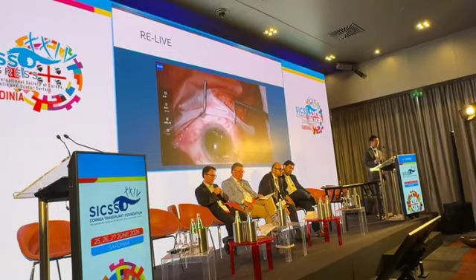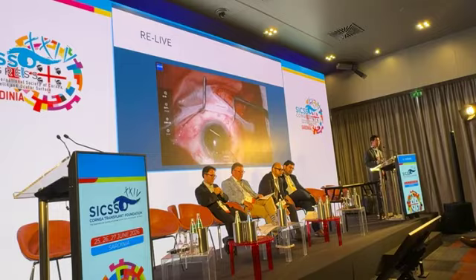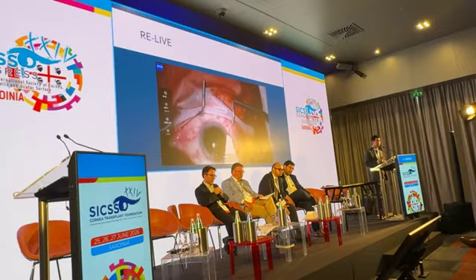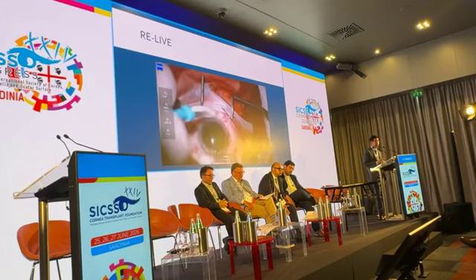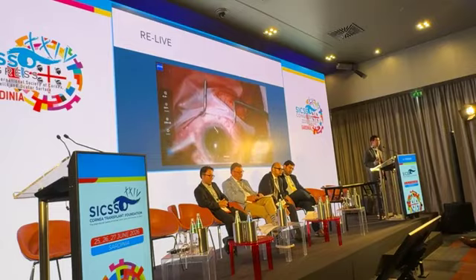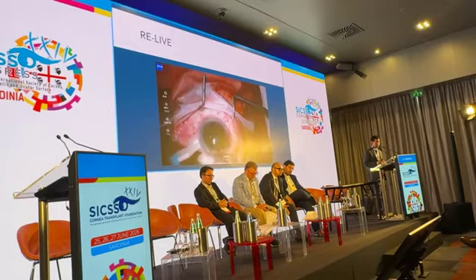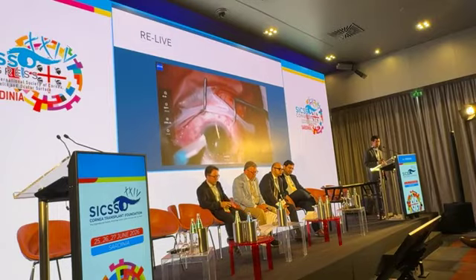The reason why I spend so much time doing this is because you want to minimize any of these wrinkles. That way, there's less chance of it sloughing off in terms of any movement of the graft post-operatively. If you look at anterior segment OCT post-operatively, sometimes you can see these fine areas of micro pockets of fluid. So I will actually put these patients on Muro 128 or sodium chloride 5% drops as well, 4 times daily. So we'll do this in this area as well. Smooth out these last wrinkles.